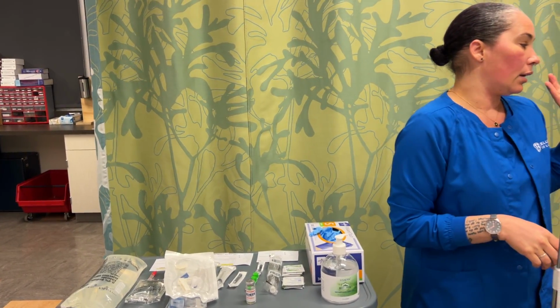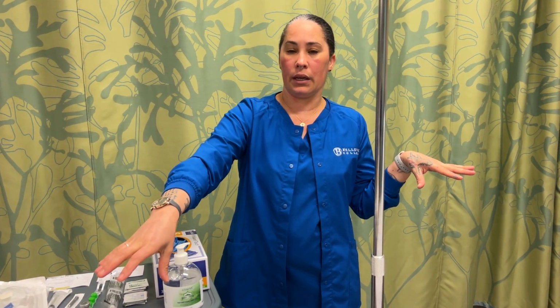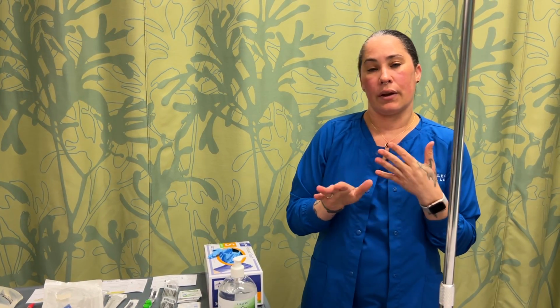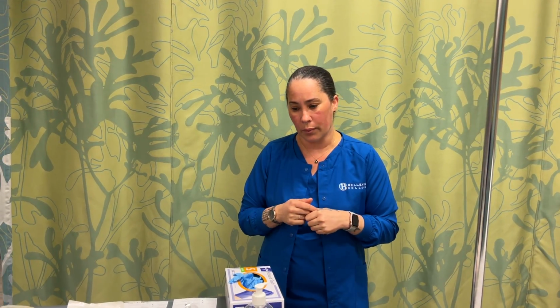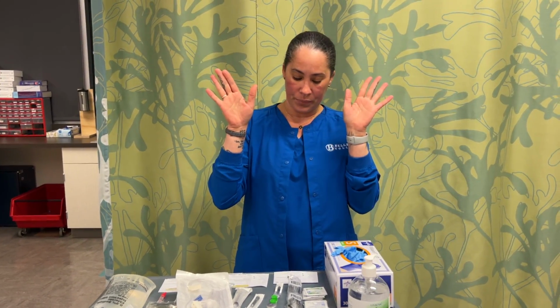That I will be checking against the system and making sure that the person who is sitting here is also the person that I'm seeing in the computer. So I will verify that, and then I will also make sure that I verify the patient's allergies. And once you find out that the patient has or doesn't have any allergies, it's time to move forward. So today we're going to start with the IV push.